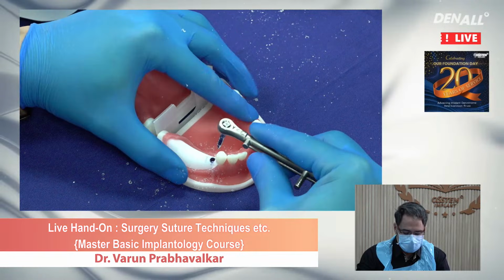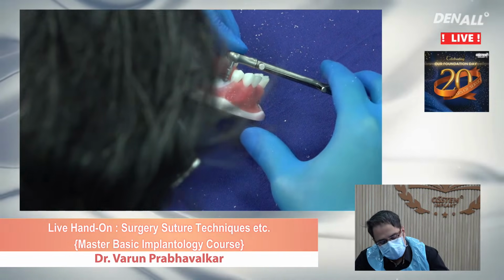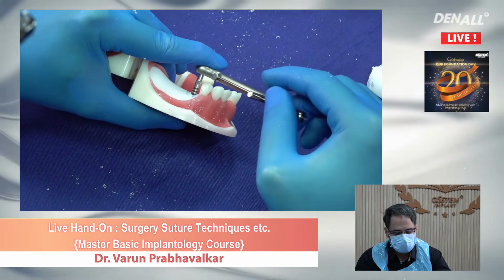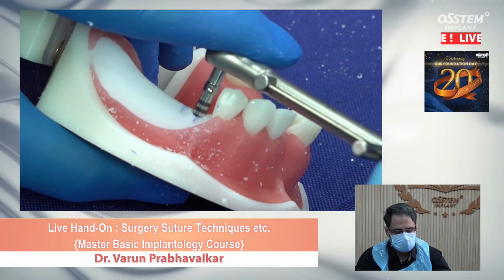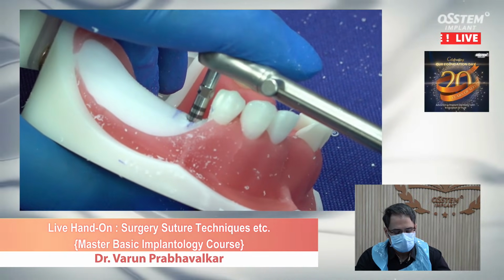Engage that. We place it in the implant, and slowly, until the marking disappears, we will torque it with the full stability. There you go.